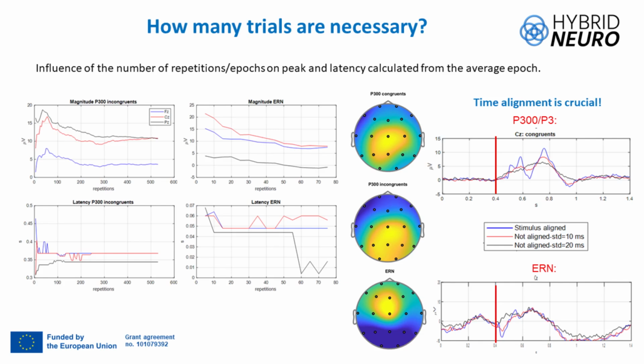If you remember, there is no potential. This is why, okay, we can always calculate the maximum, but the maximum is very small, and it's not even positive but negative. So this is why the time instant where the minimum or maximum appears changes a lot. This is because really there is no potential here in this channel.